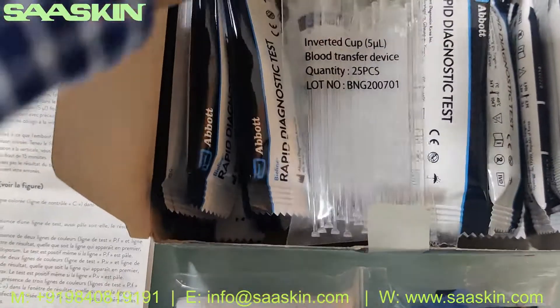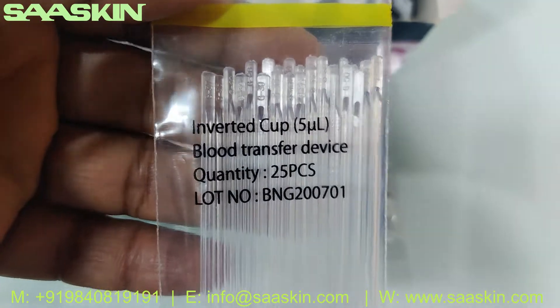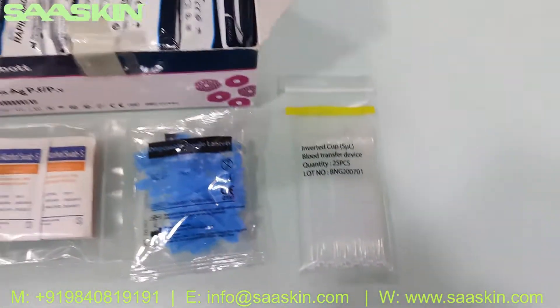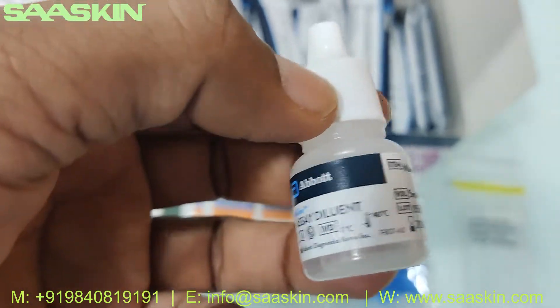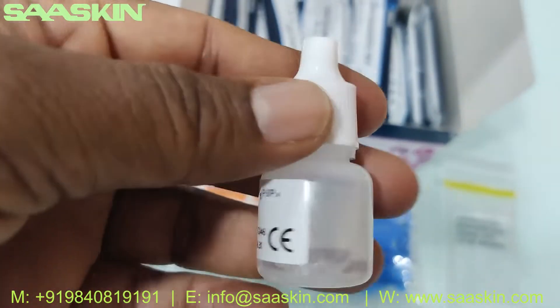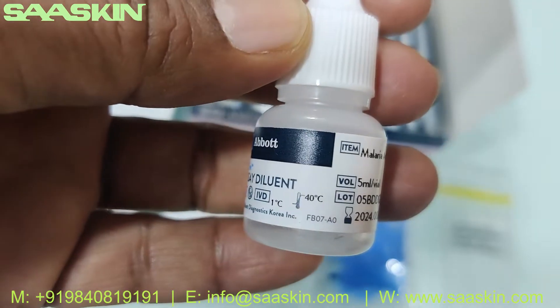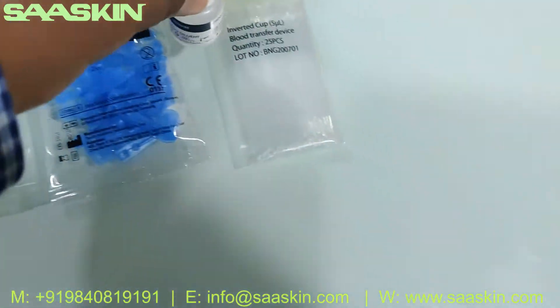Inside you also get the blood transfer device, which is the inverted cup — 25 pieces of blood transfer device. And you get one bottle of diluent buffer. This is how the bottle looks like — it's a 5ml bottle.